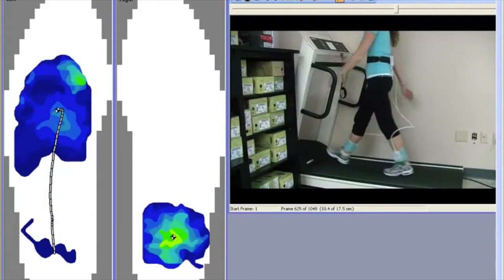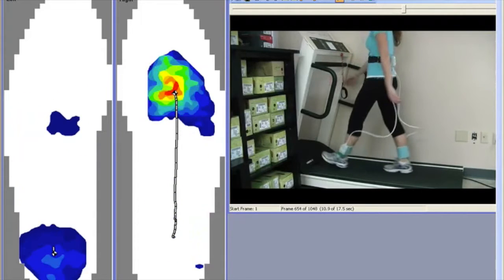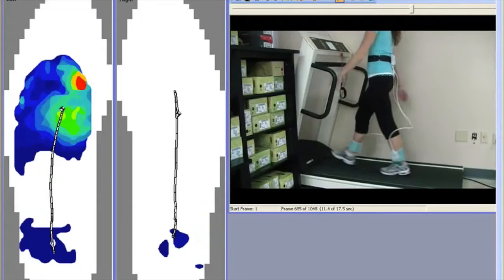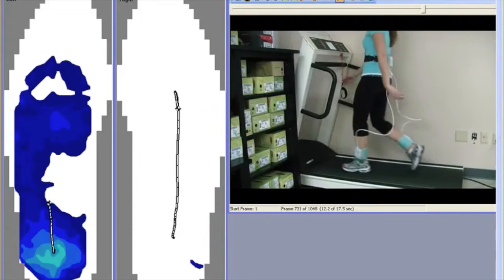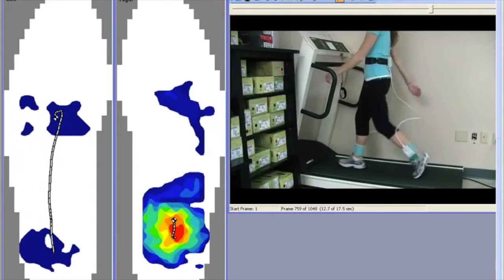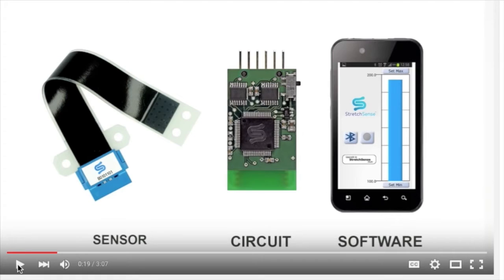However, all of this comes at a cost. You won't get a lot of change from $20,000 once the hardware, software is installed, and after you've trained your staff and brought them up to speed with operating the equipment and evaluating the output. But this is an exceptional assessment and evaluation system for your clients and something worthy of consideration.